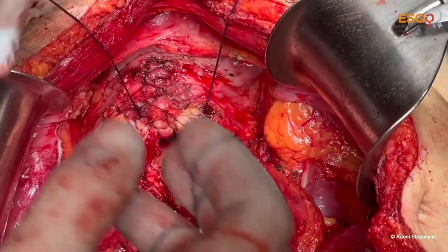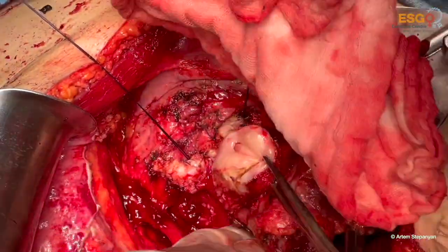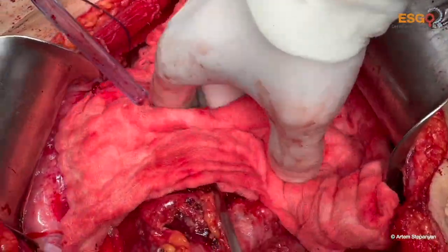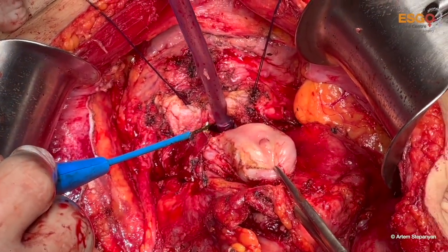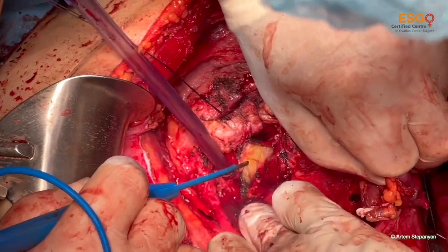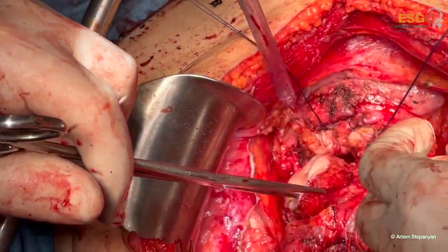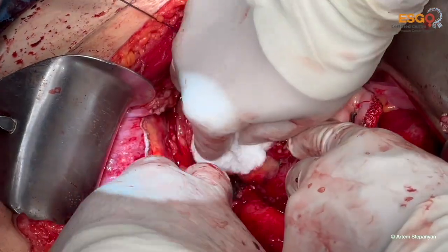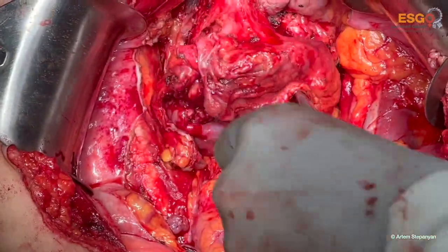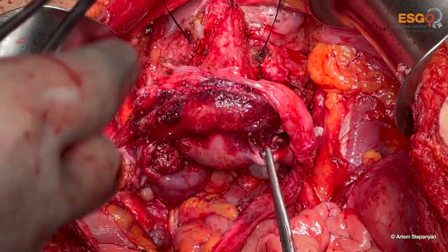So the vaginal part is completed. And now we have the uterus attached on the uterosacral ligaments and on the Douglas's pouch and the rectum. Now we retrogradely cut the uterosacral ligaments and go towards the mesorectum to detach as much Douglas's pouch peritoneum from the proximal rectum and to see whether we can spare the rectum in this case or not.